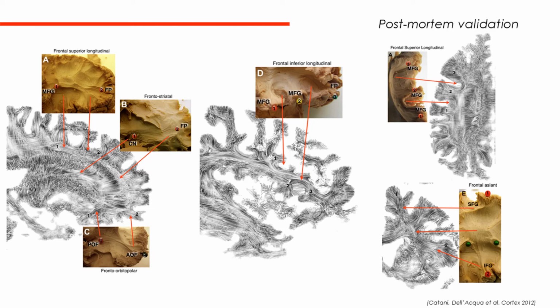So you can see this is a study we did in collaboration with Marco Catani. Using this kind of tractography, a way of visualization we call digital dissection, you can actually see in the post-mortem dissection that we can see the same structure, the right structure. So frontal tract, U-shaped fibers are there. So there is a lot of reproducibility. So clearly tractography is not perfect. There are some problems, but what we are seeing is, in a way, a reflection of the underlying anatomy. So we are getting closer and closer every day with this.